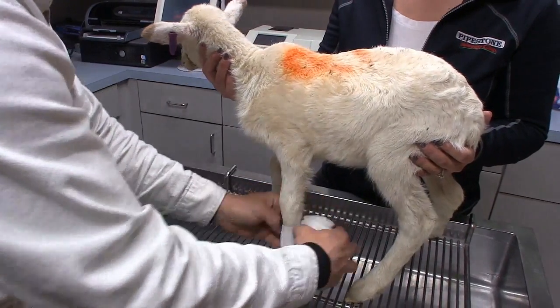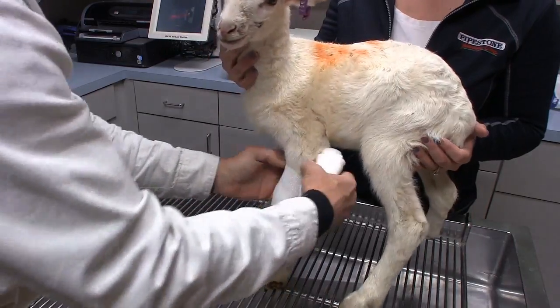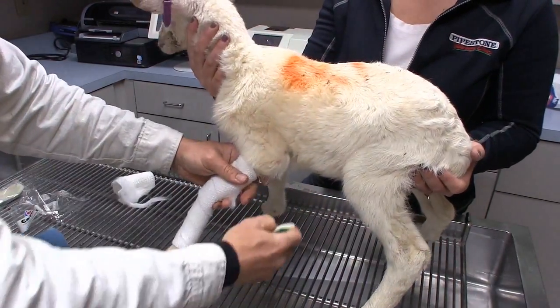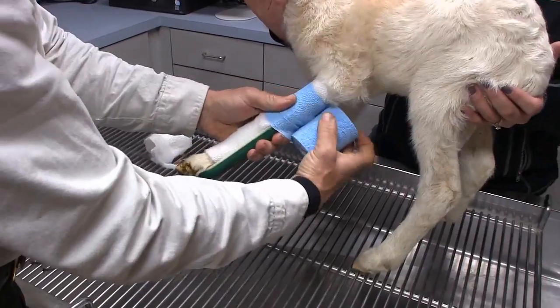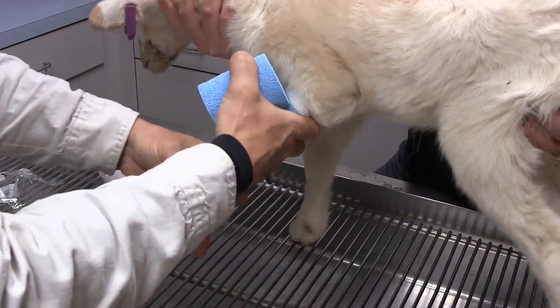This series of videos will demonstrate how to splint a lamb's leg, for example in the case of a fracture. This first video segment we're demonstrating how to splint a lower front leg fracture, so from the knee or the carpus down. First thing we do is add cast padding, which is small cotton padding to protect the skin.